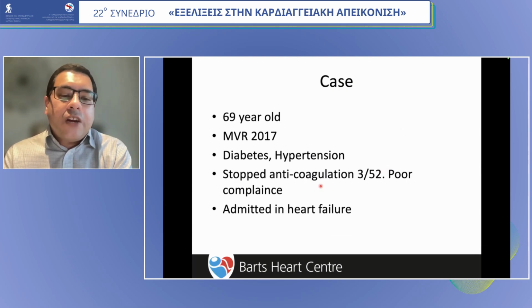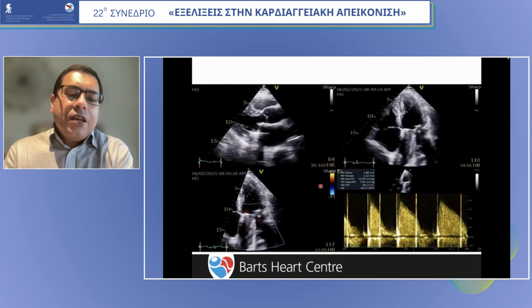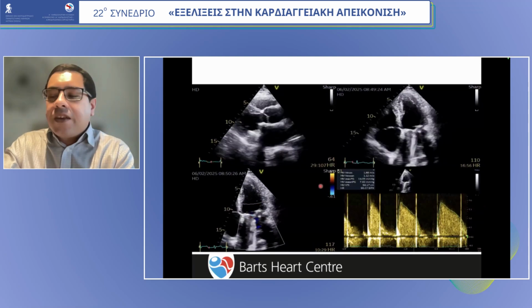So, a 69-year-old with a mitral valve replacement. This person actually stopped anticoagulation due to compliance a few weeks before, and was admitted in heart failure. This is their transthoracic echocardiogram.